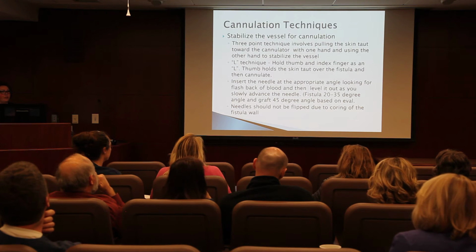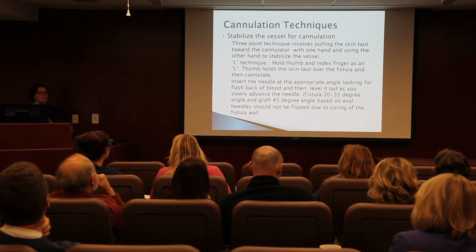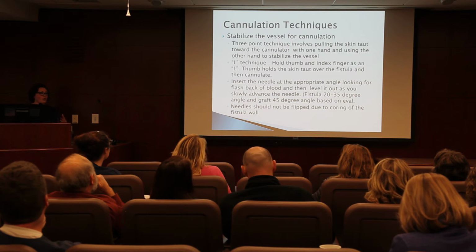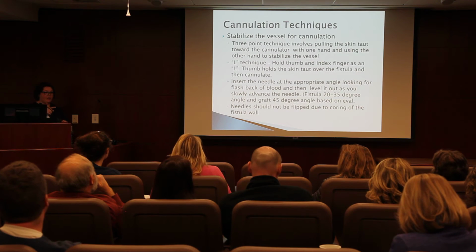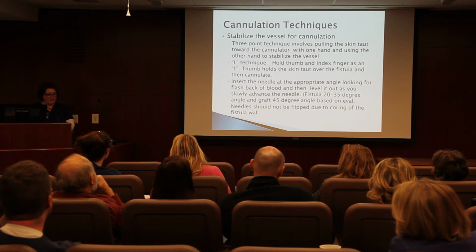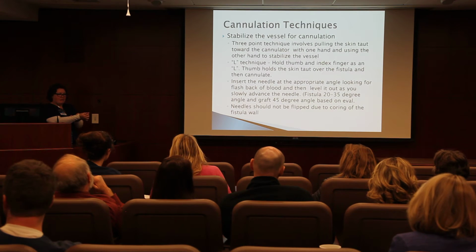So we use the 3-point technique. Everybody, this is not a must. This is not a hard standard rule. Do whatever's comfortable for you in putting a needle in. I don't always use it. If you're left or right-handed, you want to stabilize the vessel, pull the skin back taut, and then stabilize it with your finger. That's kind of hard for some people. I don't always use that.